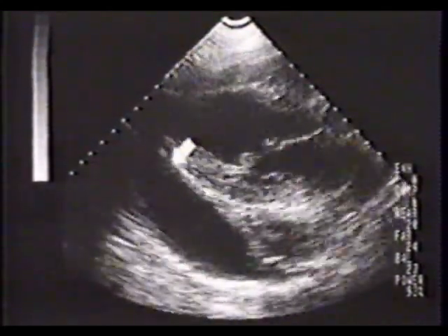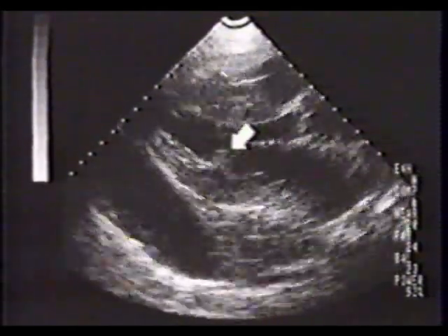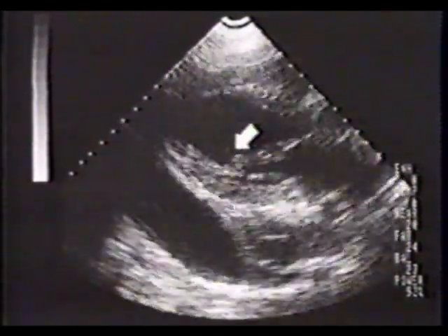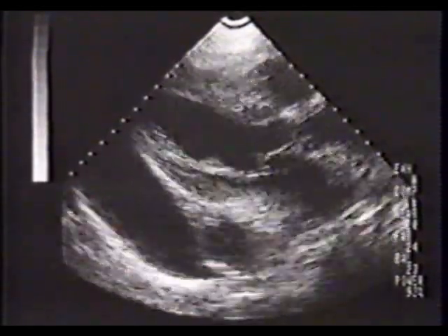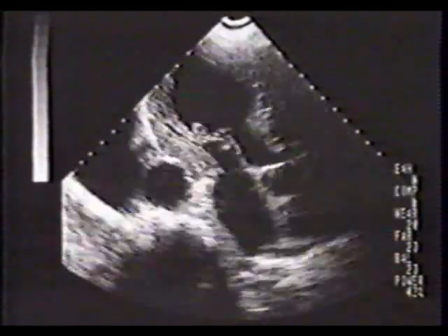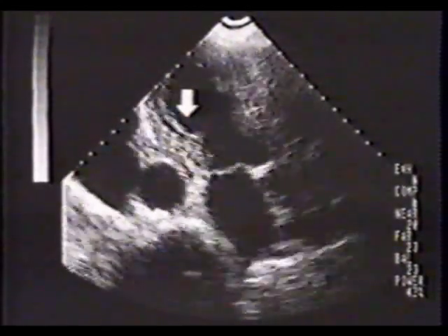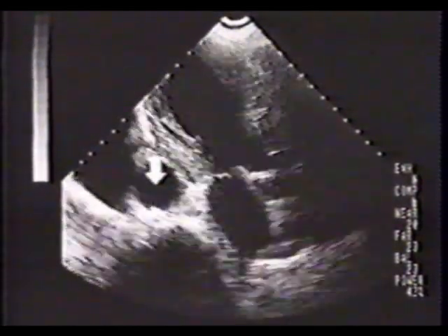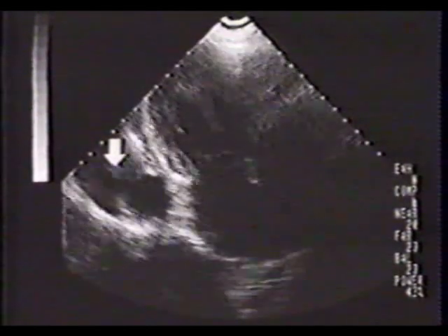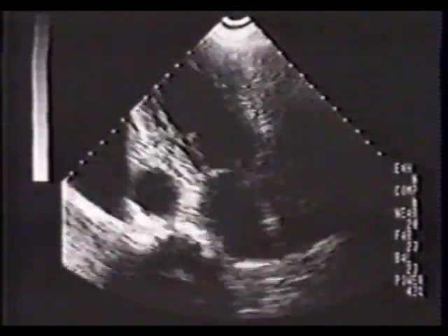This is the infarcted inferolateral wall, and you can again appreciate the wobbling of the head of the incompletely ruptured papillary muscle. This is a view of the partially ruptured posteromedial papillary muscle from the apex. The descending aorta and left pleural effusion are also evident. The patient underwent successful mitral valve replacement.